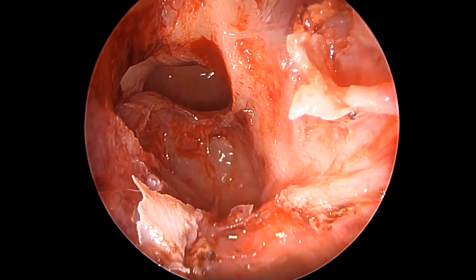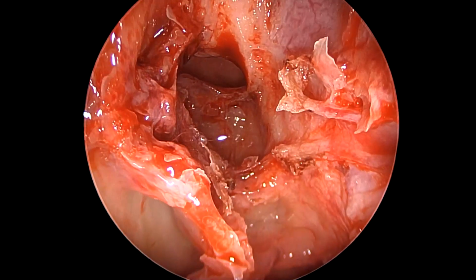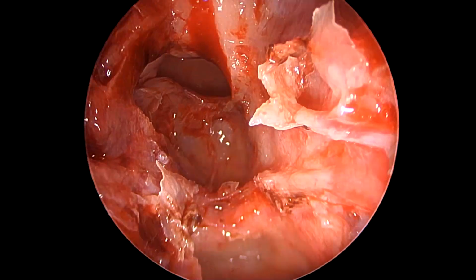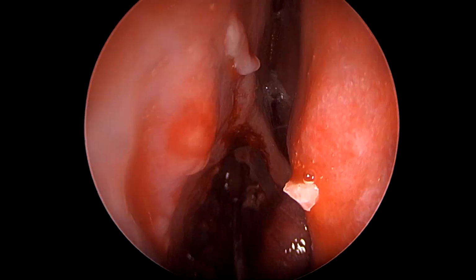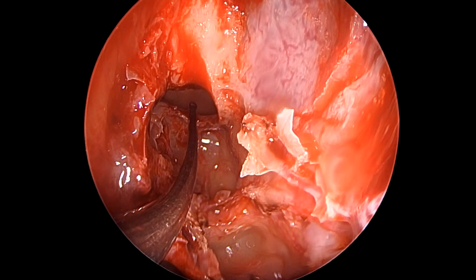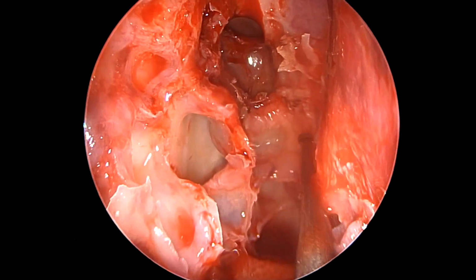And on this side, as we can see here, this is a type 3 Kuhn cell above which we have opened the frontal sinus on the right side. It's reasonably big in size, good and well amenable to irrigation. We are looking upward with a 70-degree endoscope. We are right now anterior to the skull base, anterior to the cribriform plate. Our instrument is going inside the frontal sinus on the right side.